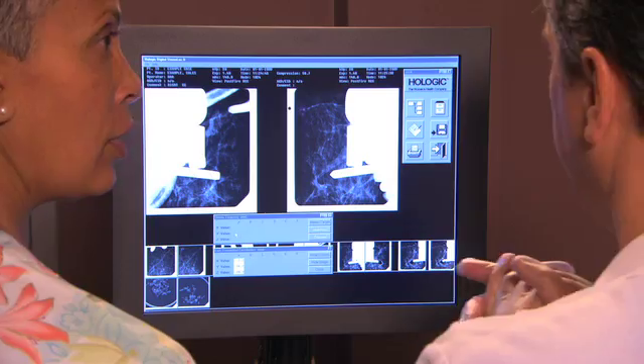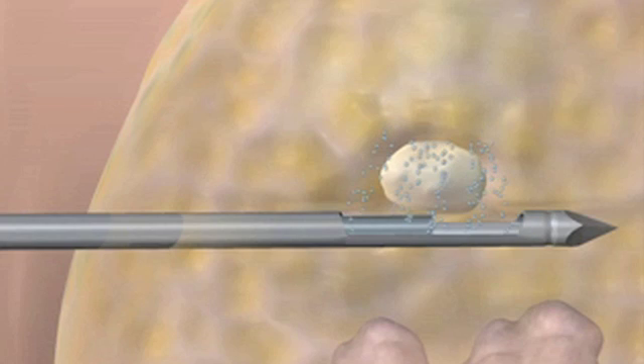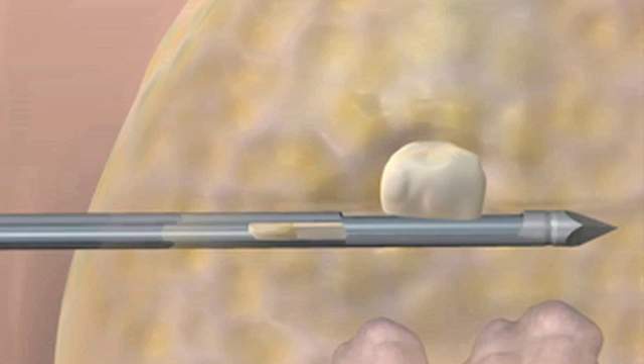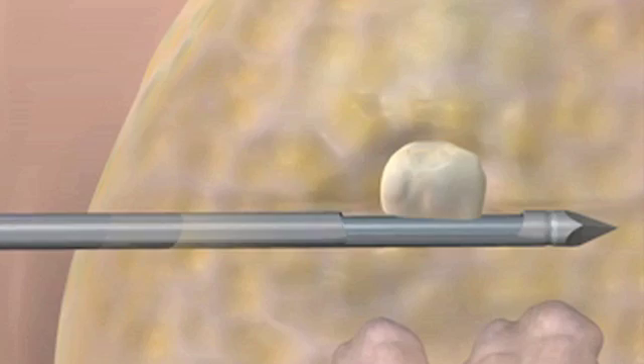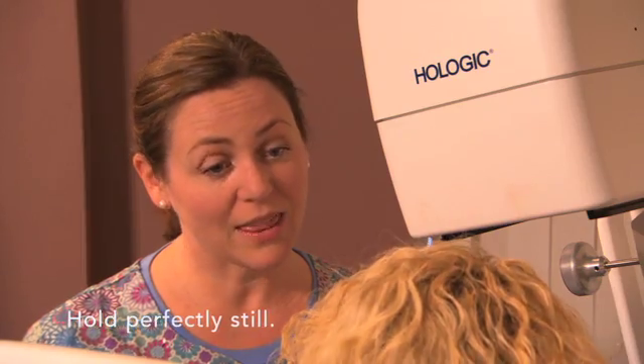They check one more set of images to make sure they've reached the area of interest. Vacuum pressure is used to take out the sample, flushing the area with fluid at the same time. A physician normally takes four to six tissue samples, which usually takes less than a minute.